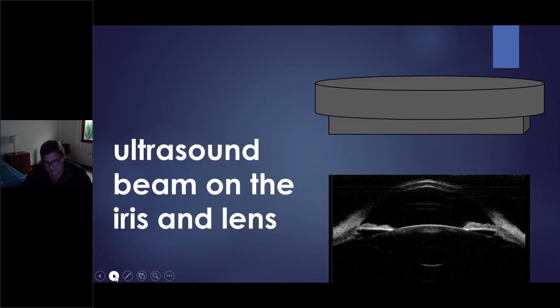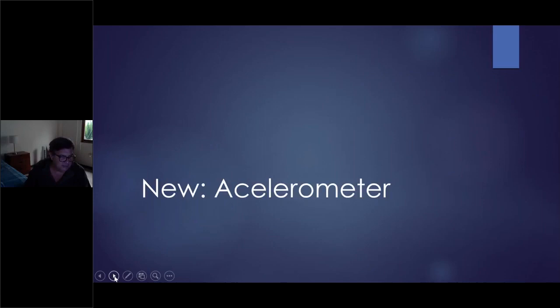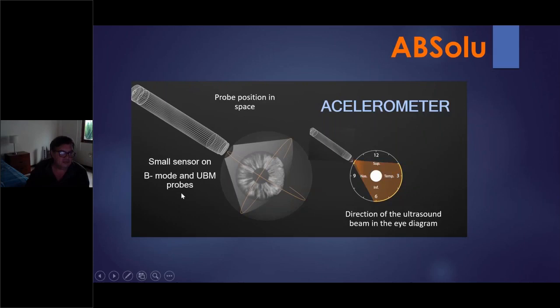A GPS inside the probe. You don't need anymore to have the rice bowl to make the positions. You don't need to guess, even in B mode, and that's the reason I want to show you the other presentation, the accelerometer. What is an accelerometer? This is a small sensor in B mode and UBM, and it shows you the position of the probe in space and the direction of the beam in the eye diagram. Very, very interesting.